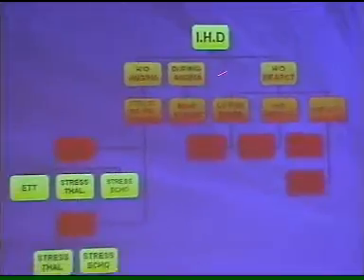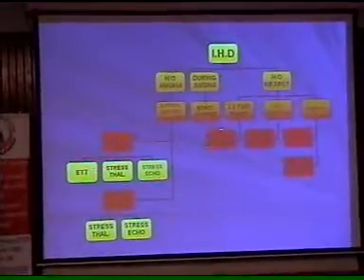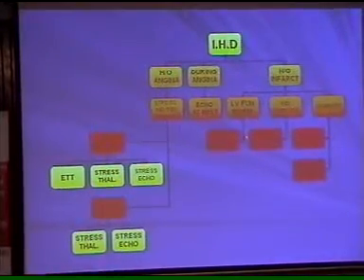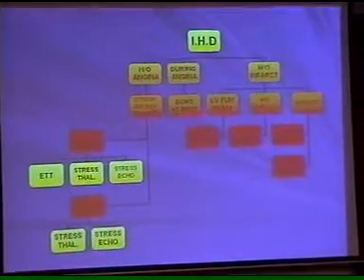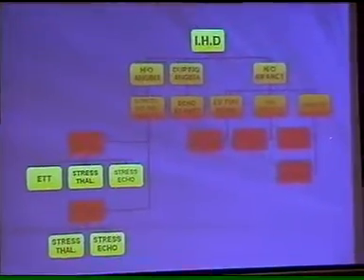If you are interested in regional wall motion analysis and LV function, then of course it could be echo at rest for function and wall motion. If you are planning for the status of ischemic heart disease and its complications, obviously echo at rest. But if you are planning to study it further for prognosis, for risk stratification, or to study viability, obviously you have to go for stress thallium or stress echo.